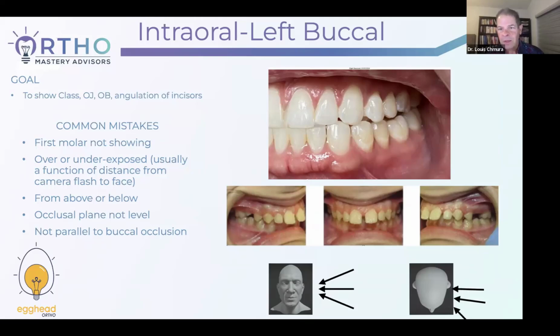That upper picture is Elijah's teeth. You can't tell if it's class 3 because they didn't take it properly. Now, they took them the same. You'll see in the next error slide, the same one. But no, you can't see the classification. So he's 5 years in and he's worn his teeth down. You can see in this picture that the upper lateral is small, but that wasn't accounted for in the treatment plan. You can also see on that lower right, well, the lower three are the same patient, right?